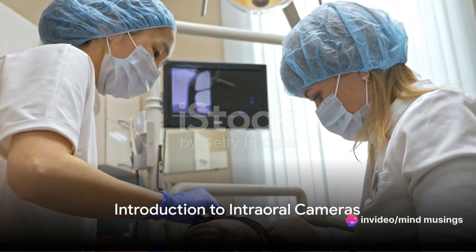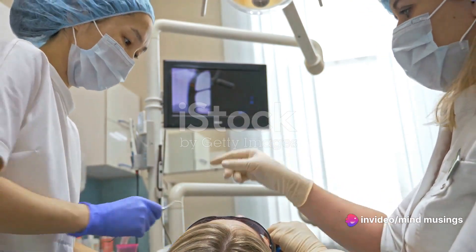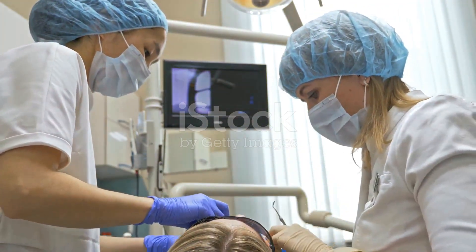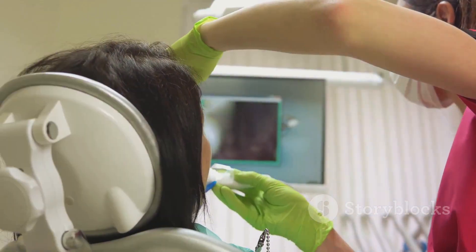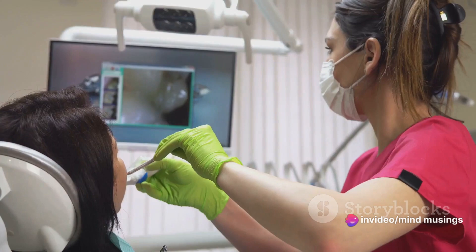Ever wondered how your dentist gets a close-up view of those hard-to-see areas in your mouth? Imagine a tool that could provide your dentist a detailed, magnified view of your mouth, making diagnosis and treatment a breeze. Welcome to the world of intraoral cameras.